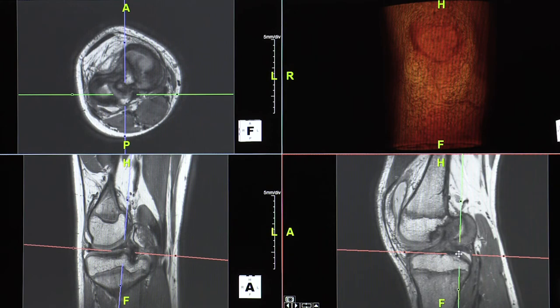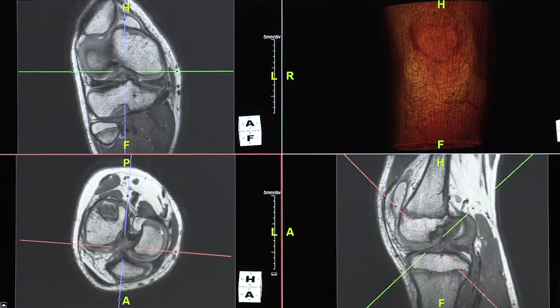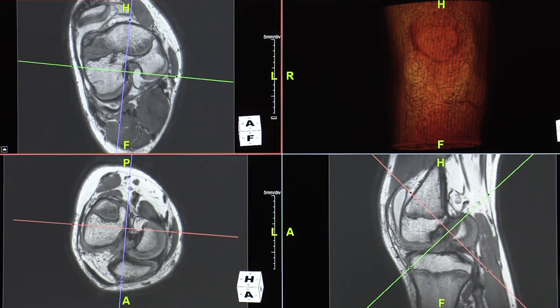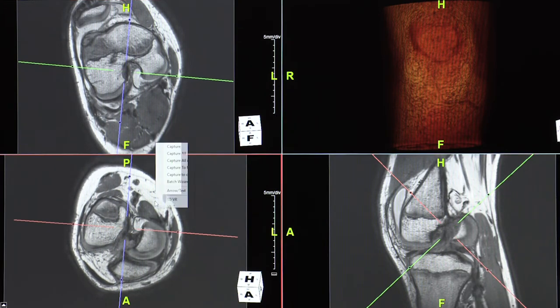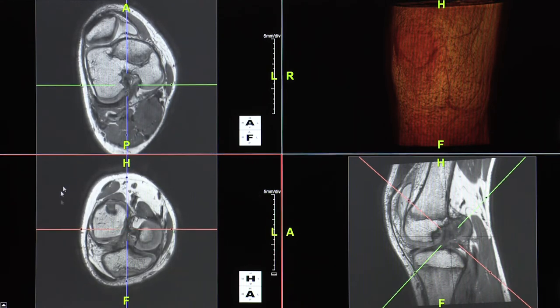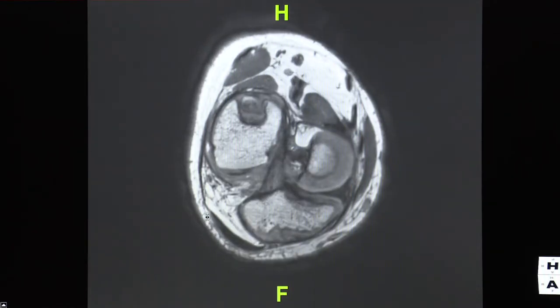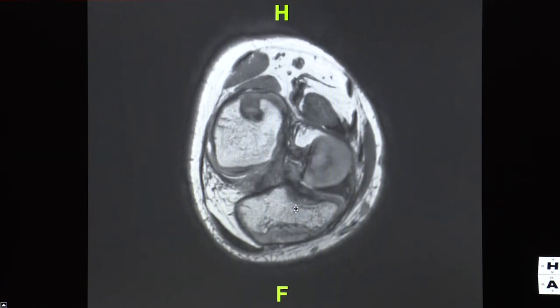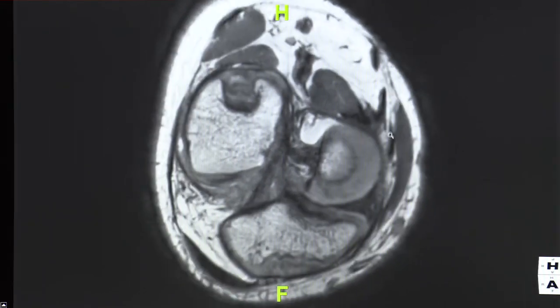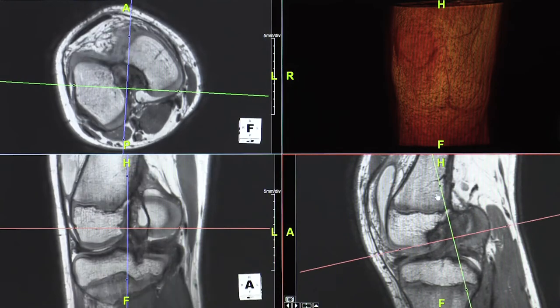To see the ACL and PCL, I outline along that structure and bring it this way to find the ACL. I reset to start where the ACL is and bring it along the ligament. If you magnify that, you can see the anteromedial bundle and posterolateral bundle uniting and attaching — that's your ACL. You can magnify and take pictures as needed.